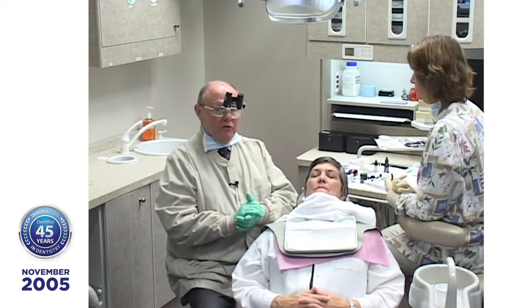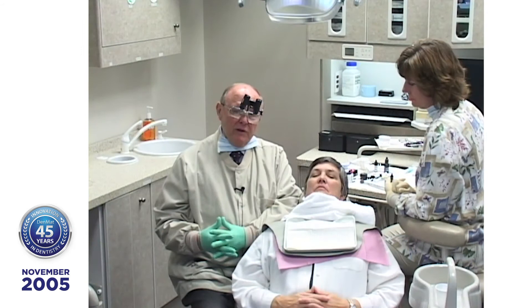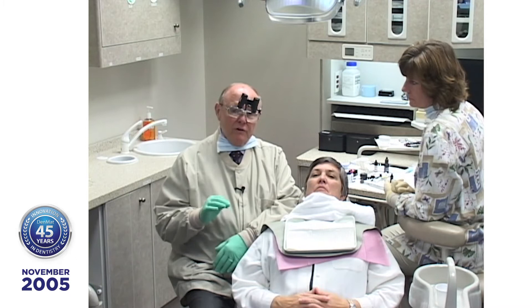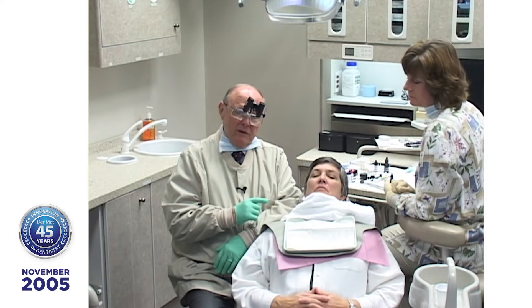It's very important to have a good impression material. We recommend the luminaire impression material because it's a two-bodied system and you get really nice margins. Before you send your cases in, pour a model and be sure you're satisfied with the integrity of the margins. If you have to retake the impression, the patient will still be in your office. Don't take the impression out too soon — wait an extra minute — because many times the lumineers will fit the model but won't fit the teeth.